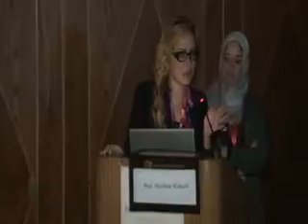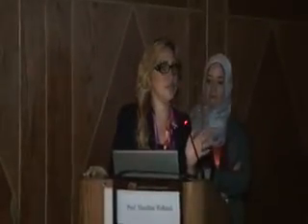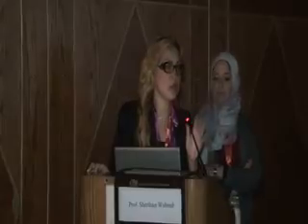I think Dr. Nagla wanted to ask a question. Just a comment. I want to just clarify, when we speak about MRI of the breast, it should be high field. Most of the high field are closed system, and when they refer to the open system, it's for the high field open system. There are available 1 Tesla with open field, not to send around a message that we can do biopsy on the low field magnet like 0.3 Tesla or so.